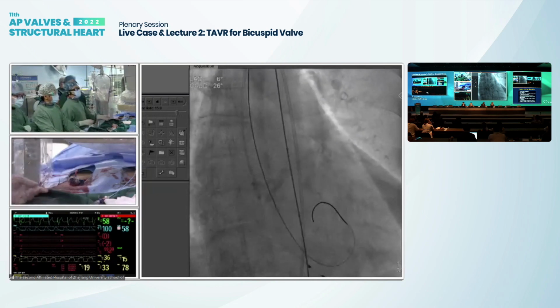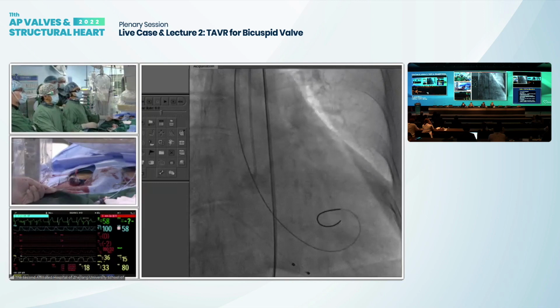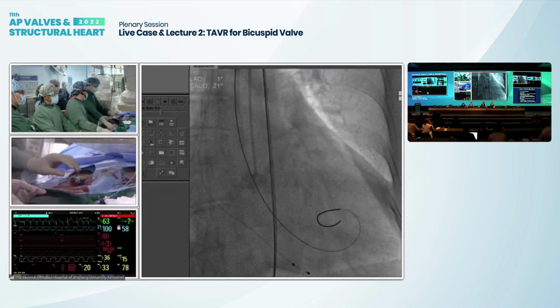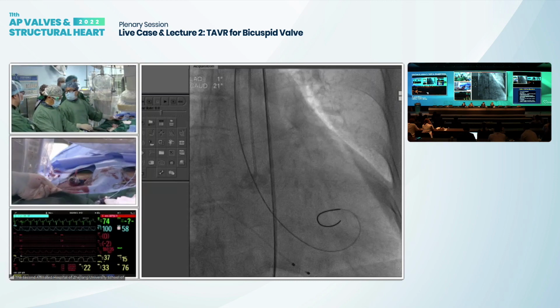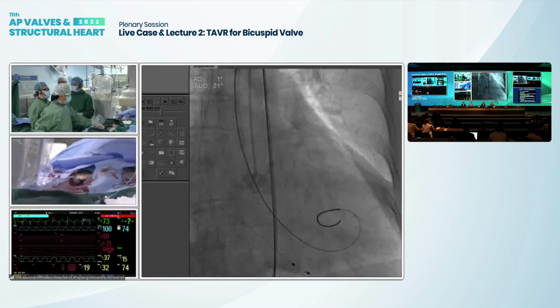So, 3 also. You like to go back to the high version, right? The three versions. You like to go to the high version and see what that looks like. Yes, we still expect a little higher deployment. It is better a little lower than the first time, but higher than the last time. Yeah. But it is not so easy to achieve the height. Maybe still go back to the first time or go back to the last time.